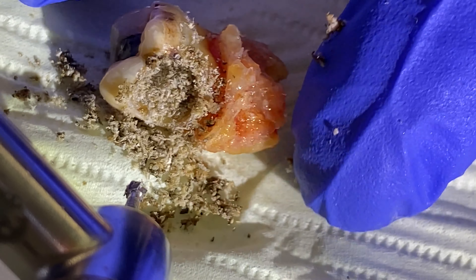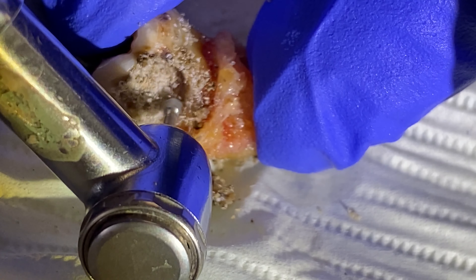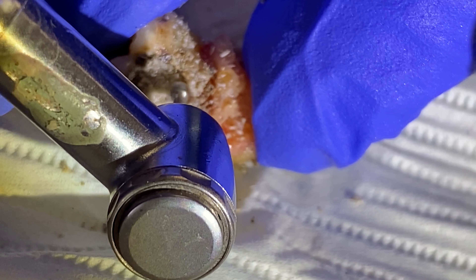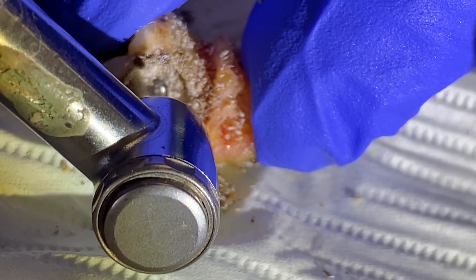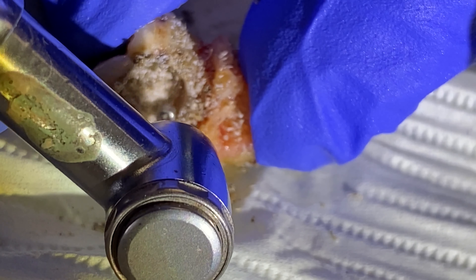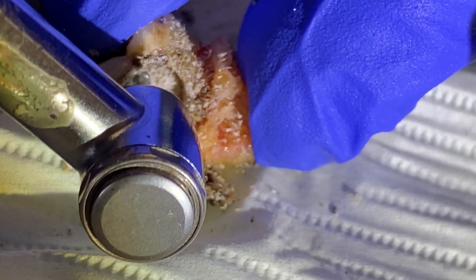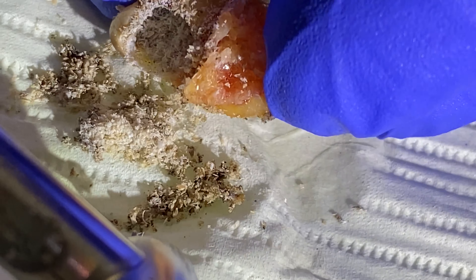There it is. Now you know you're getting into cleaner areas when instead of mush you're getting filings that get lighter and lighter. It means there's less bacteria and stain and junk inside — so the lighter you get, typically the better. That's what we see.